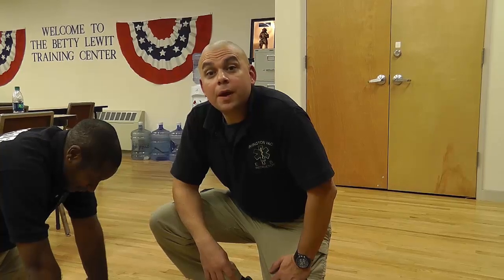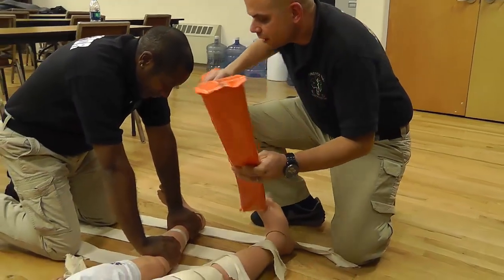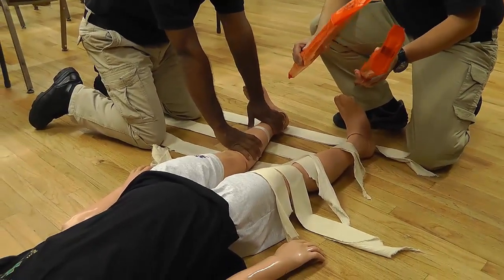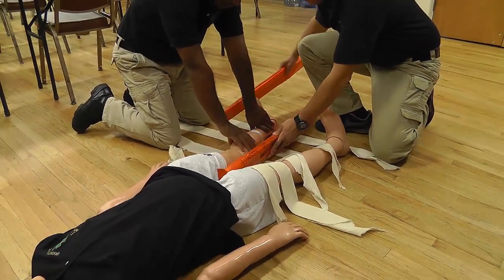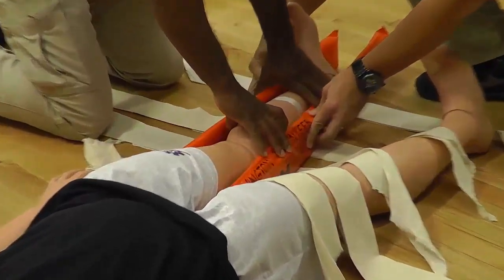Now it's time for the long padded board splints. I'm going to take my long padded board splints and put them padding side to the patient's leg on either side of the leg, and my partner Brandon is now going to maintain stabilization using the padded board splints.